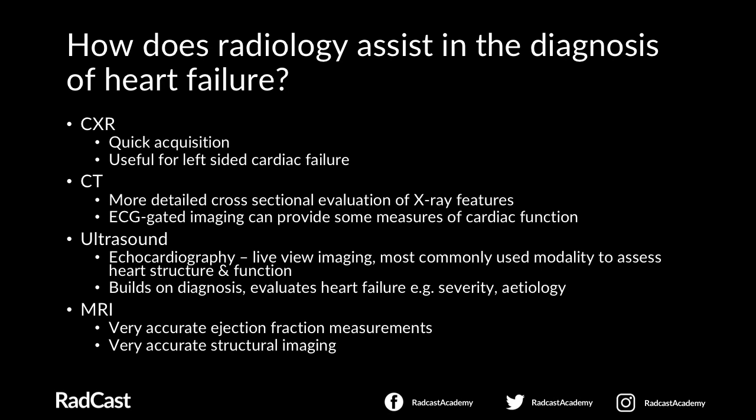But what you're not going to get with a chest x-ray is a thorough evaluation of heart function or such detailed information. It's a picture taken at one snapshot in time, so you're not going to see how the heart pumps in real time or gain any measurements of important parameters like ejection fraction or valve gradients or anything that's going to provide any particular diagnostic value.